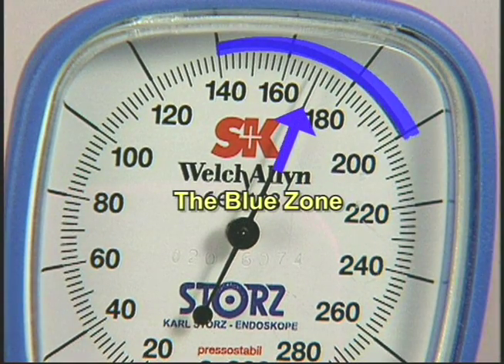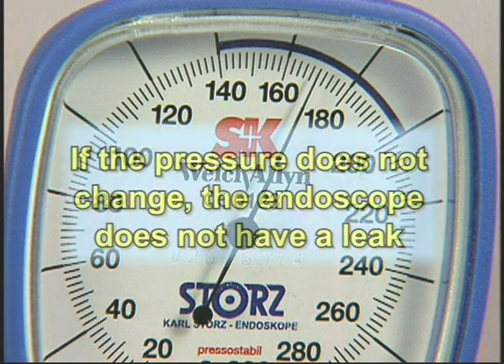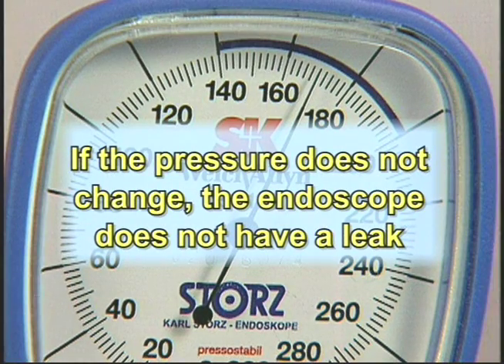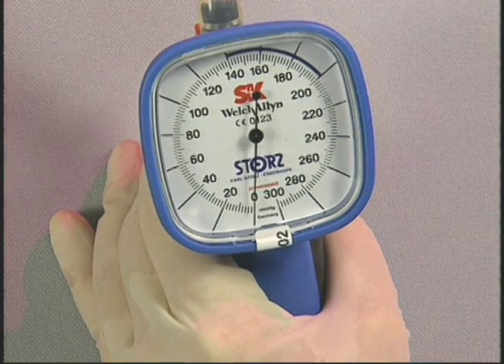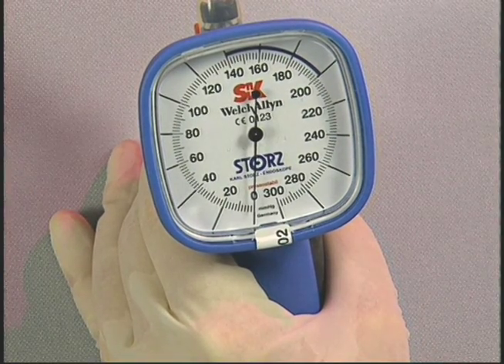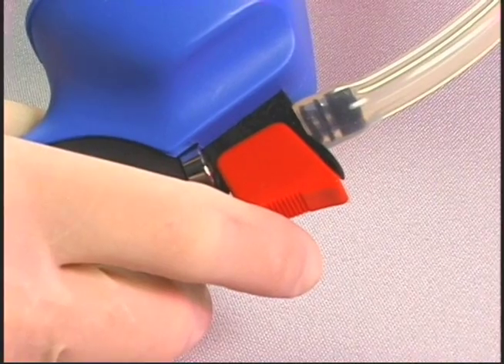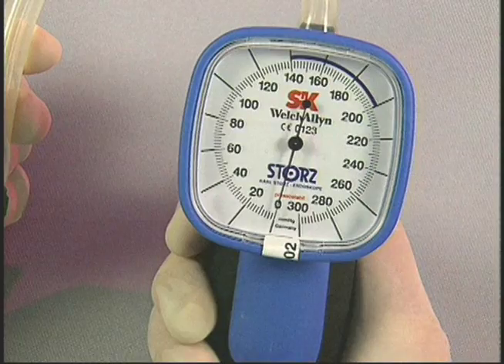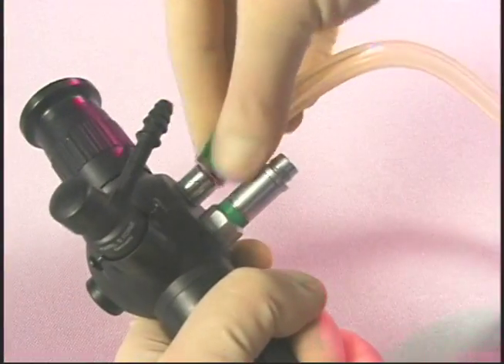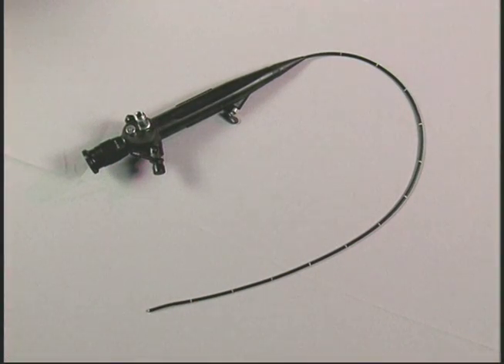Increasing the pressure beyond the blue zone can seriously damage the endoscope. If the pressure does not change, the endoscope does not have a leak. If the pressure rapidly drops below the blue zone, there is a major leak in the working channel. Call your Karl Stortz representative or customer service immediately. To release the pressure, open the red pressure release valve. When the indicator needle has dropped to zero, disconnect the leakage tester. If no leakage was found, continue cleaning of the endoscope.